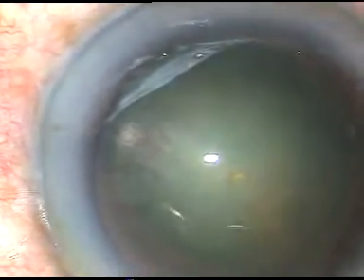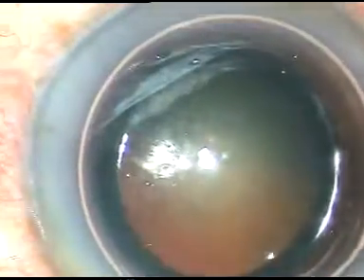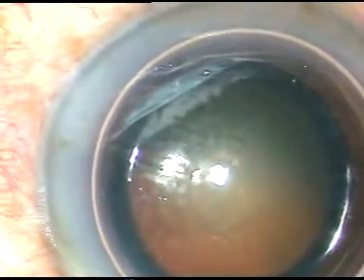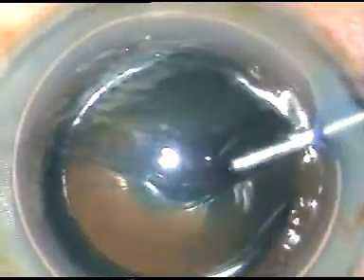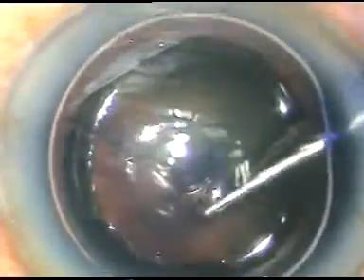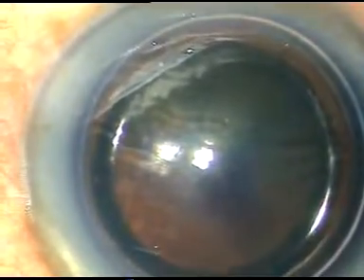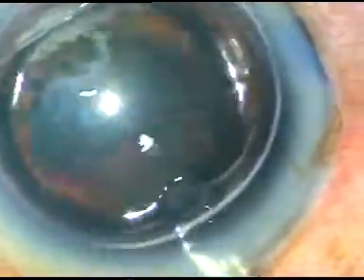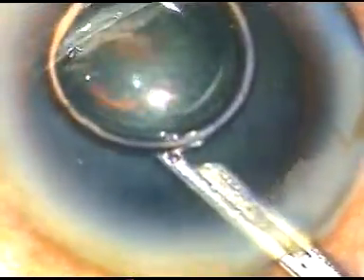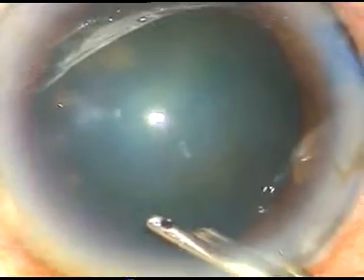I am going to stain the anterior capsule with trypan blue dye to show the rhexis very clearly. An air bubble has been injected. Here goes the dye. The dye is sprayed evenly over the anterior capsule, and now the dye is washed out. You need not wait more than 6-7 seconds — staining occurs in 6-7 seconds.